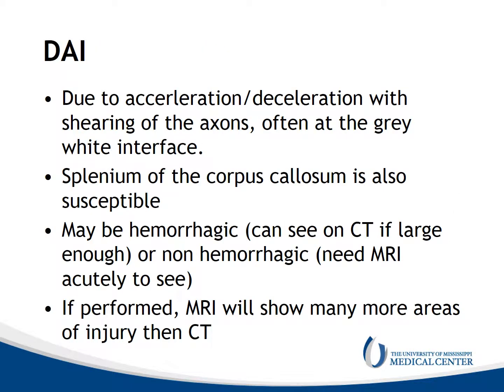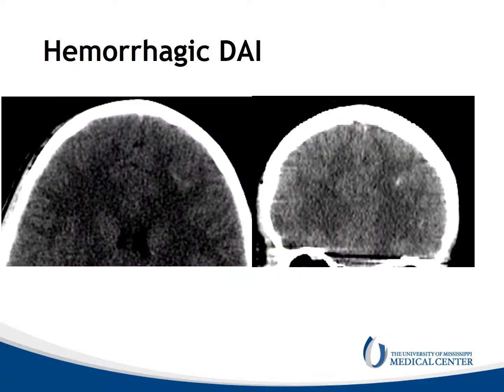Diffuse axonal injury is another source of intracranial hemorrhage in trauma. It's due to acceleration and deceleration where you get shearing of the axons, often at the gray-white interface. The splenium of the corpus callosum is also very susceptible. These may be hemorrhagic, and if large enough, we can see them on CT, or non-hemorrhagic, where MRI is needed. MRI will show far more areas of diffuse axonal injury than CT. Here's a small area of hemorrhagic diffuse axonal injury showing hyperdensity in the left frontal lobe at the gray-white junction. Subsequent MRI showed additional areas.